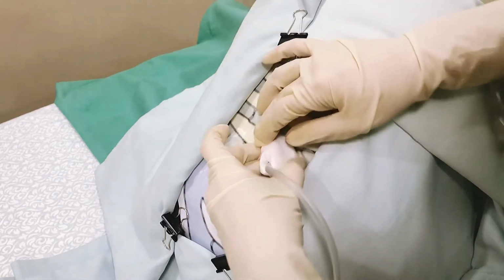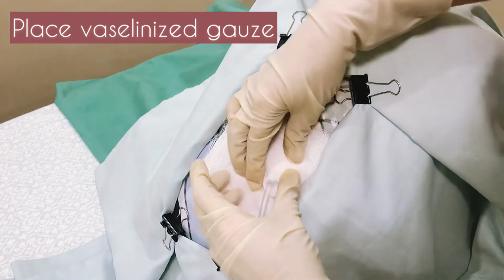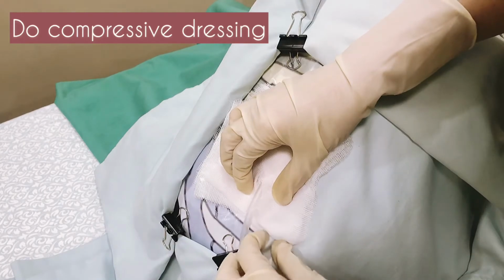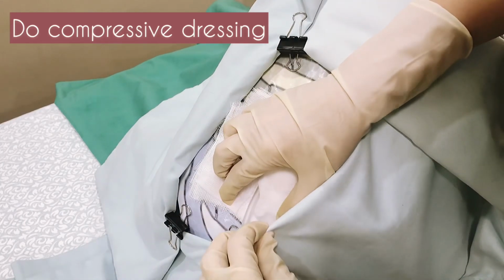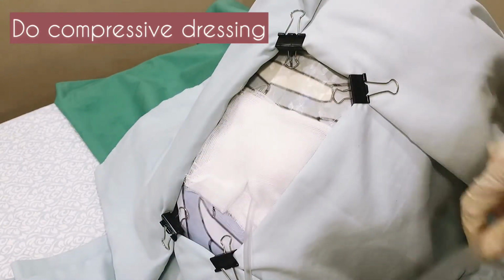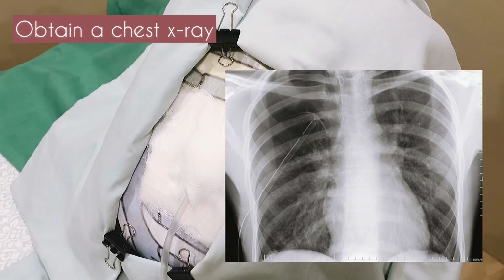Place Vaselinized gauze dressing around the tube and push it with one hand to prevent air leak. Next, place the 4x4-inch gauze and create a slit at the center. Place them 90 degrees relative from each other to avoid slipping. Secure the gauze using the plaster. Obtain a post-tube insertion chest X-ray to check the position of the tube.